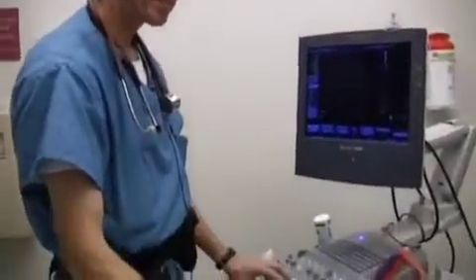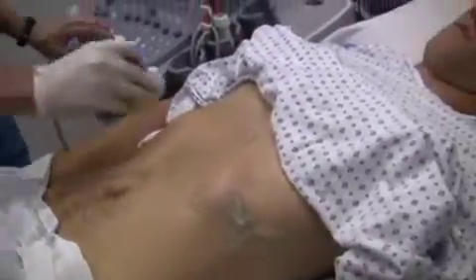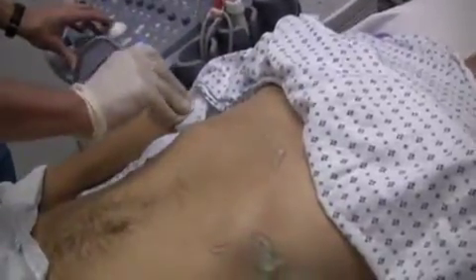We can run through this once more in real time. I probably won't be able to speak fast enough to keep up, so I'll just do the exam. When you watch, you can make sure that all ten potential spaces in the four regions are examined.